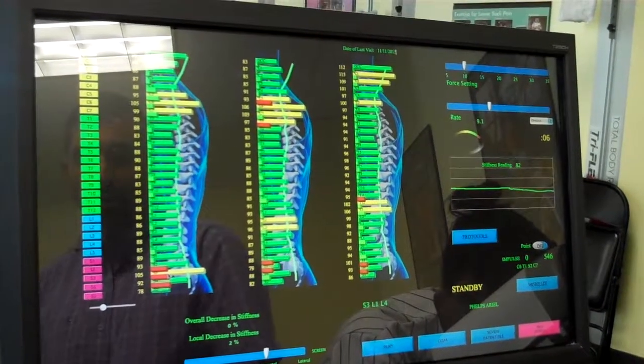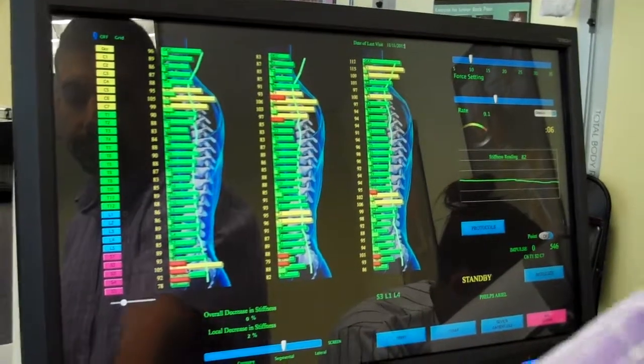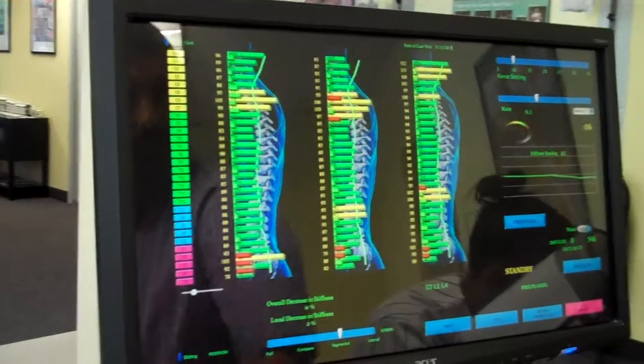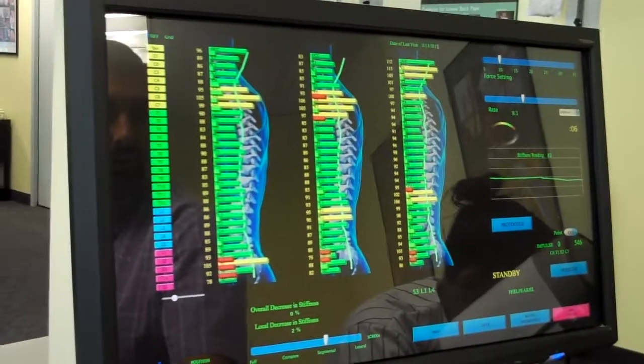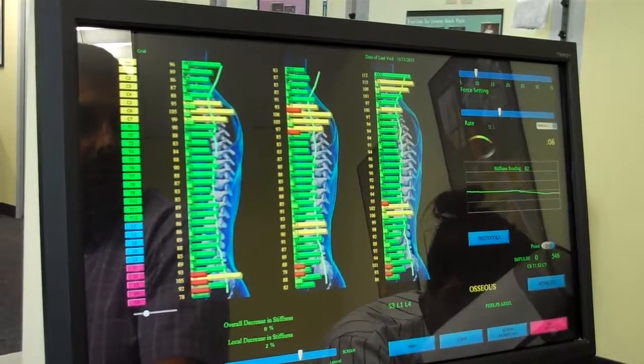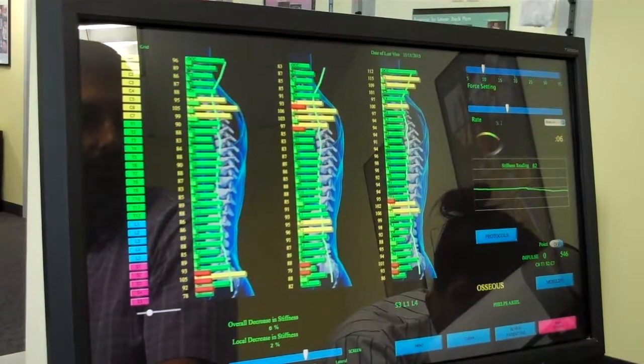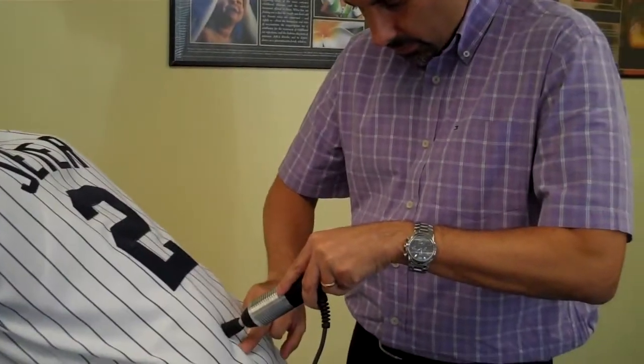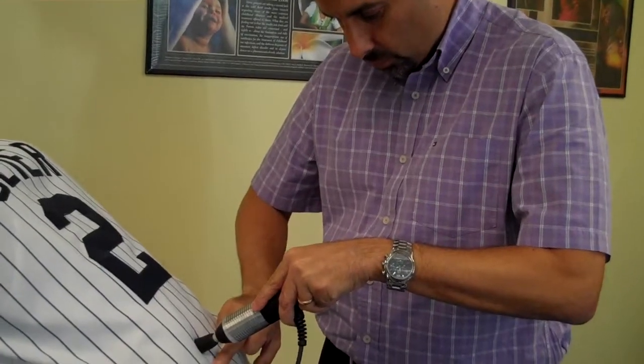So one of the things that you can do is go into a standard protocol of muscle relaxin. What we can use is one of the small rubber tips. Put one of the small rubber tips on around the sacral area. Let's put it on 20, which is a good number to stimulate the sacral and paraspinal muscles in the lumbar spine.